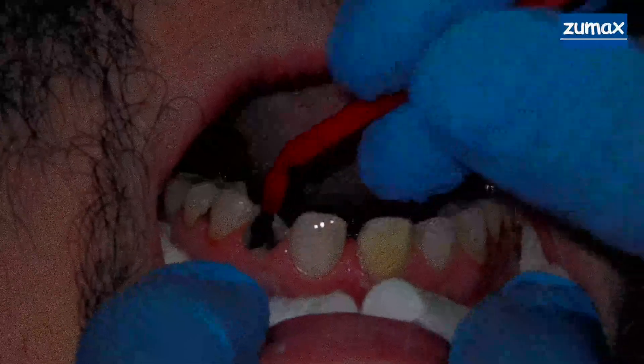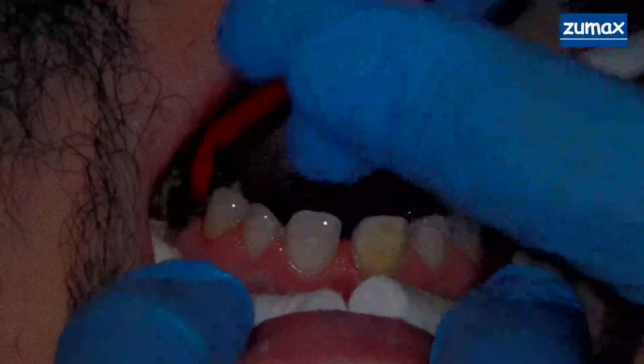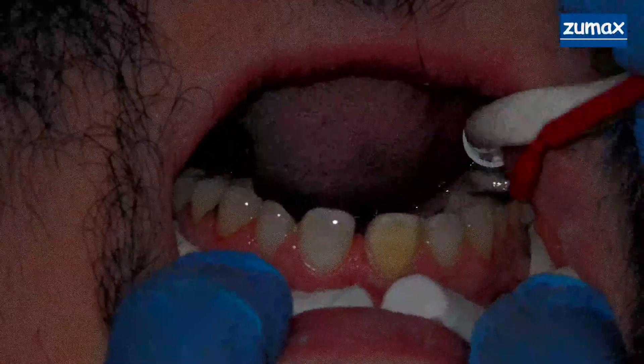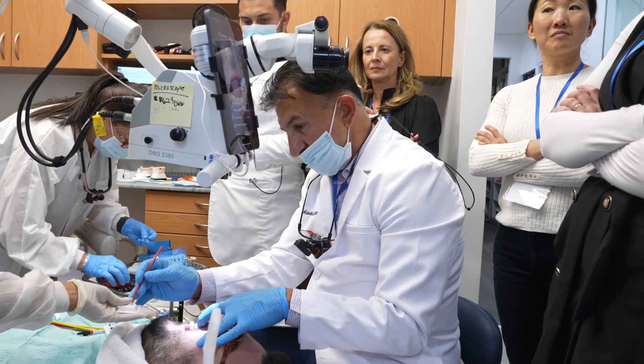See number 8 — a little bit darker. When you have a darker tooth, you're going to use a little bit of flowable XL2. Tori, say hello. They can't hear you.